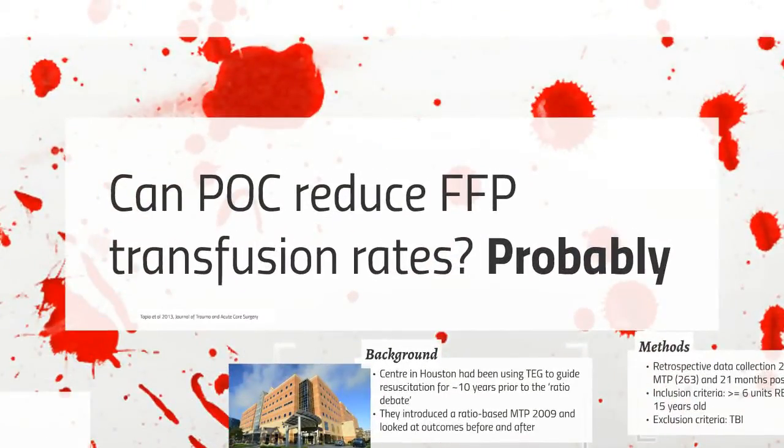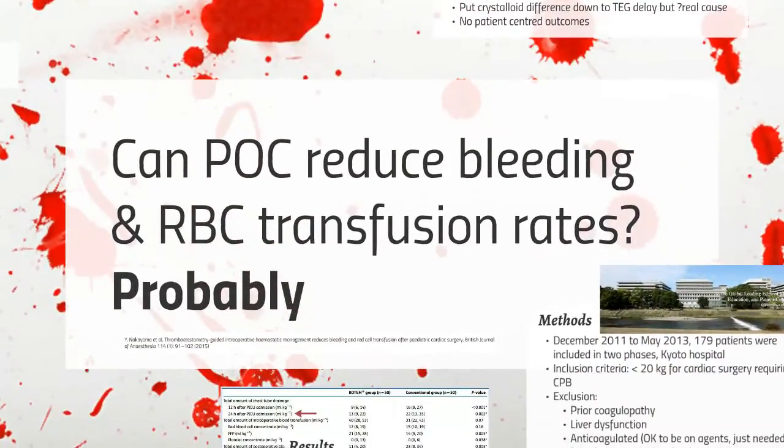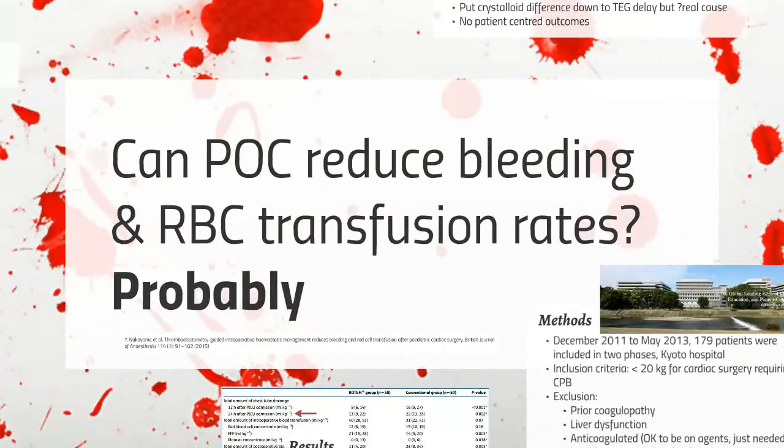So, can it reduce FFP? Probably. This is a study from Houston, and I'll just skip it. Actually, I'll just come back to it. It's a bit different. They were actually using TEG at, I think it's the Ben Taub Trauma Center in Houston. They were using TEG way before the ratio stuff became popular, and then they switched to the ratio stuff. So they did it the opposite way to most people. And anyway, they just looked at their case controls and found they were using more FFP without TEG.